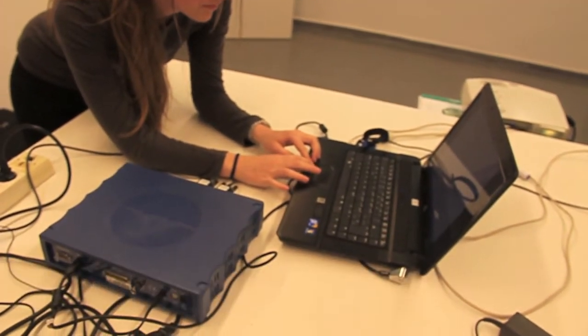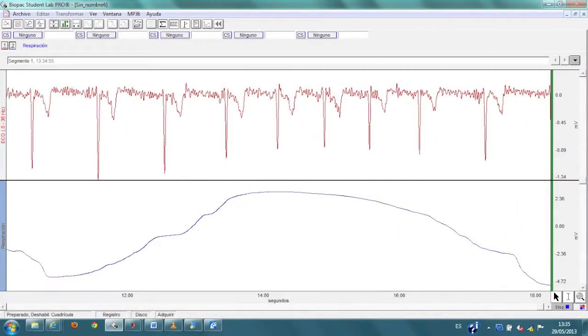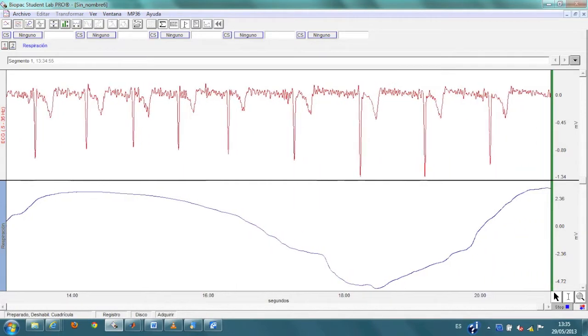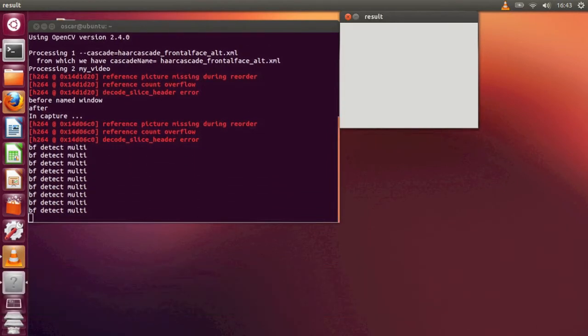The idea is to compare our measure captured by the webcam with the BioPAC, a gold standard. We are using a bulb, as the fluorescent in the lab introduces other frequencies that distort the system. Now we are capturing a video with the webcam during a minute, the same time that the BioPAC measures. After video recording, we initialize the script that will run the rest of the program.